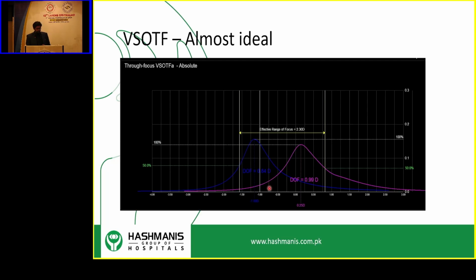Yeah, so you can see that this particular curve of his right eye, it overlaps with the left eye, but it's overlapping in such a way that there's an elongation of the point of focus of the two eyes, and that's why he can see near and far. Of course, with this technique, you still have to be very careful that his brain has the ability to adapt to this much of a difference. And you would want to put him on contact lenses before you do the surgery.